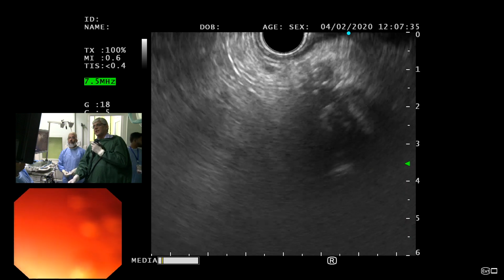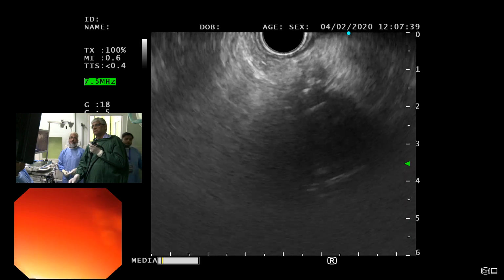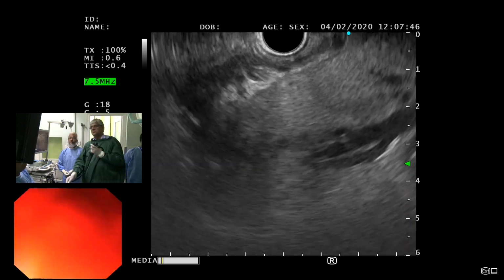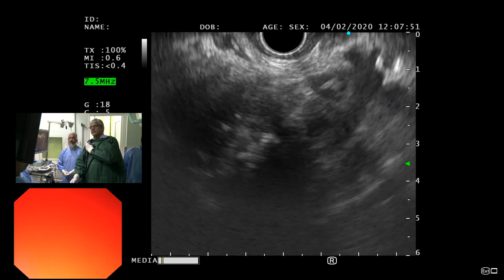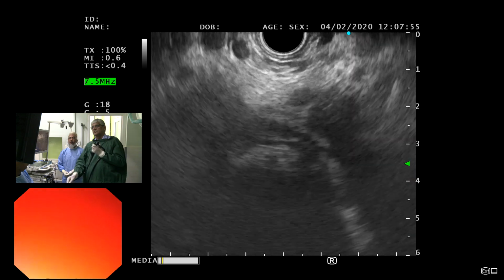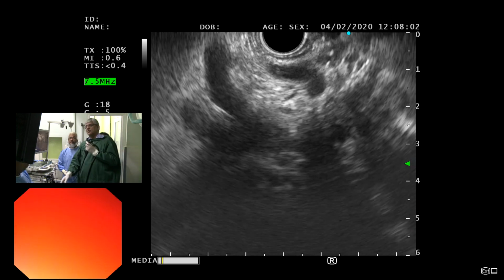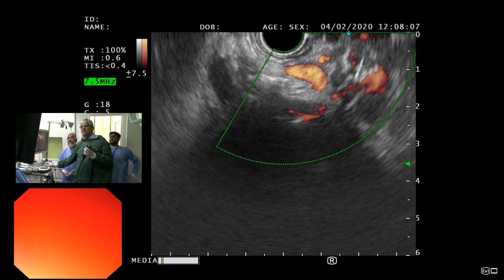There are so many varices here. Can you appreciate that? Let's see if we can see the kidney here. It's actually slipping off. Here I'm just trying to see the PD, but I'm not sure because everything here is a vessel. See that? These are all varices there.